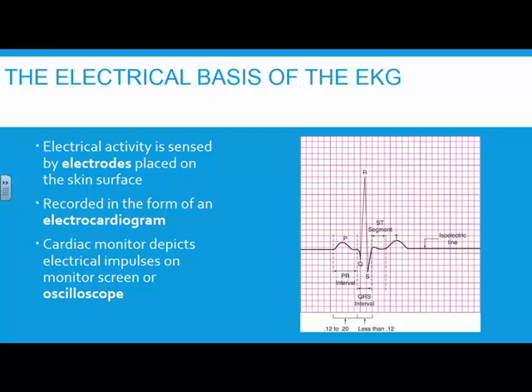Dr. Willem Einthoven, a brilliant scientist, suspended a silver wire between the poles of a magnet. Then two skin sensors placed on a man were connected to the ends of the silvered wire, which ran between the two poles of the magnet. That's important, the two poles there. Each time the heart beat, that wire in between those two poles would twitch because of the electrical stimulus.